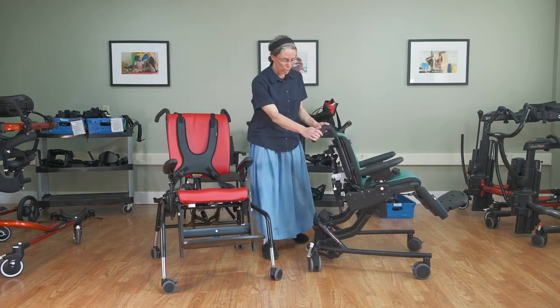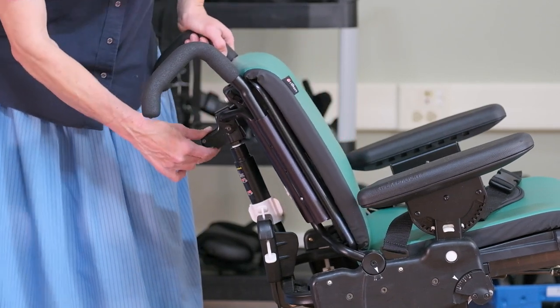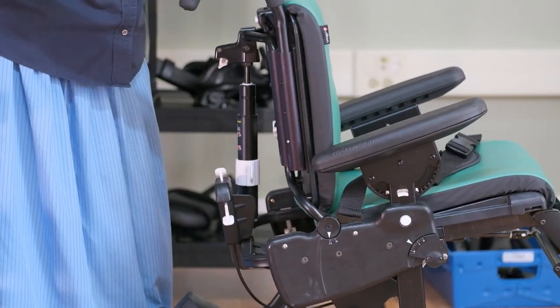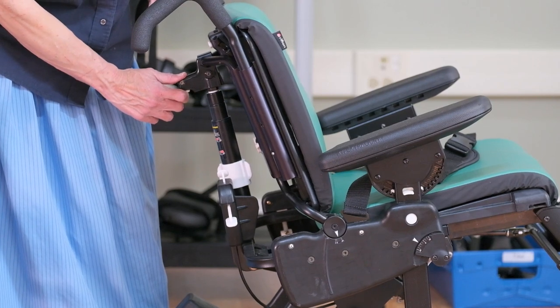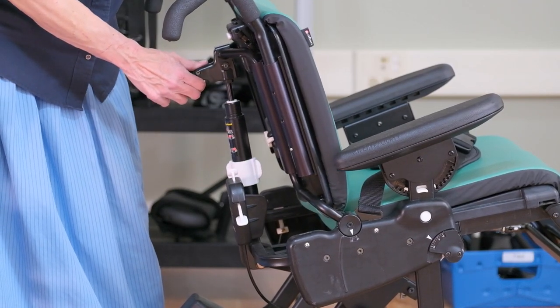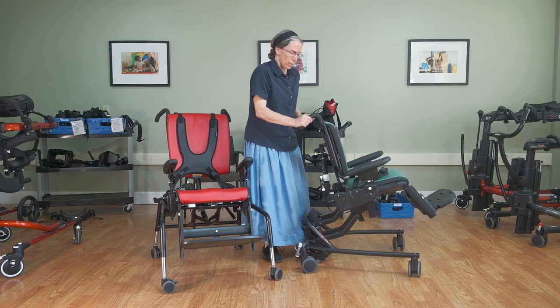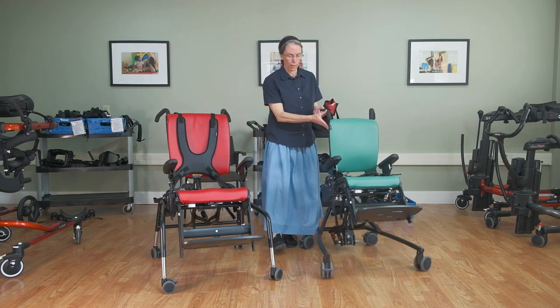Another dimension with adjustment is the backrest angle, which also has a nice index. It's important to be aware that if you choose the dynamic spring, you only get the full range when the dynamic spring is unlocked. Once you lock it, that will limit either end of the range — if you lock it in the forward position you won't get the full recline; if you lock it in the back position you'll get full recline but won't get that forward angle unless you unlock it. This is very nice for kids who have repeated extensor tone — it accommodates that and prevents them from sliding forward.